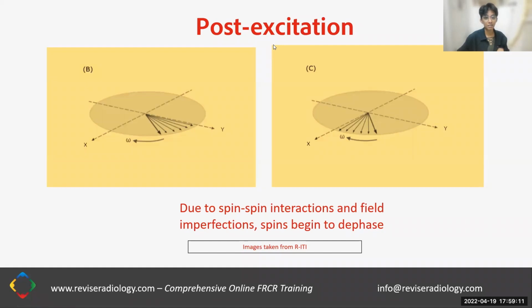And next, the thing that we're looking at to understand T1, T2, T2 star is what happens post-excitation. So I have one more video for this. Okay. Recording continues. Now we are moving to the relaxation processes, which come after the excitation processes. And these depend on two things: the interaction of these magnets with each other and the interaction of the magnets with the lattice in which they're embedded, that is the molecules around them.